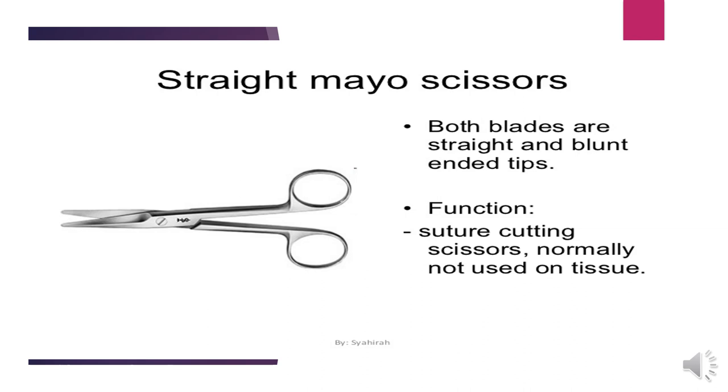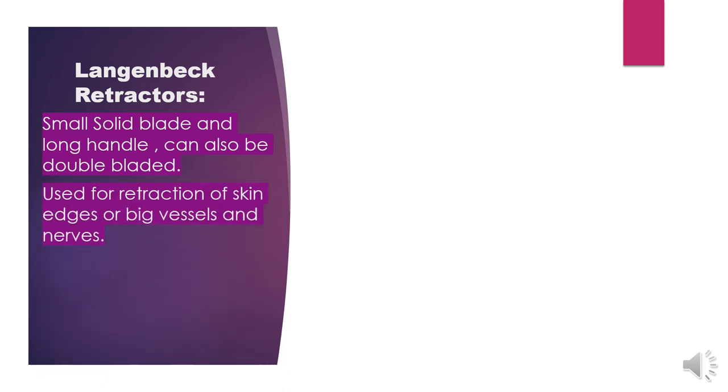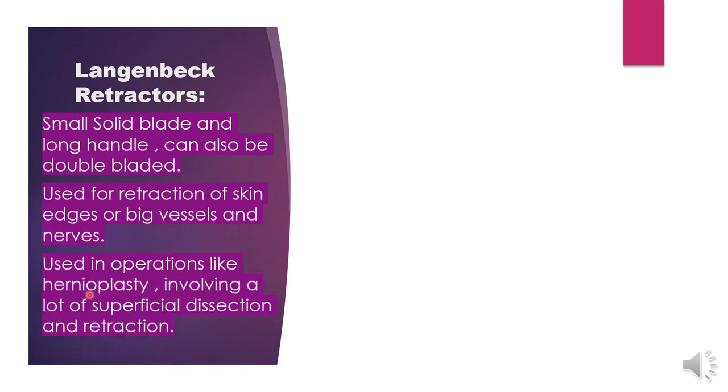Next, in the general set, we have Langenbeck retractors. Langenbeck retractors have a small solid blade and a long handle. They can also be double-bladed — single blade or double blade. They are used for retraction of skin edges, big vessels, and nerves. They are used in operations like hernioplasty involving a lot of superficial dissection and retraction. The blade is small and solid with a long handle, allowing superficial edge retraction.